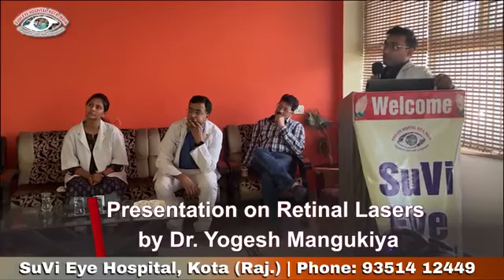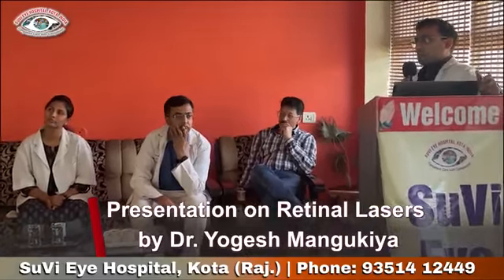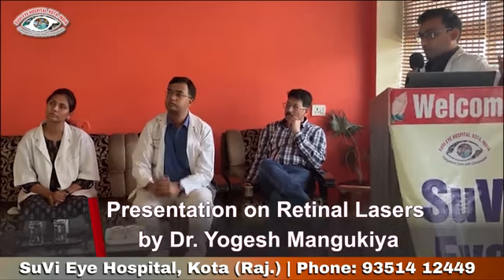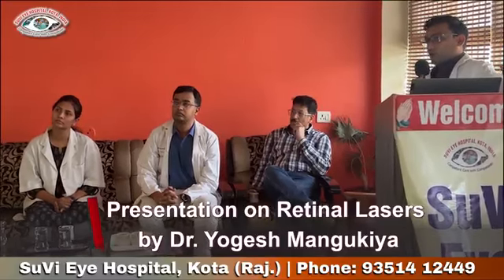Usually for retinal photocoagulation we use around 100 milliseconds duration, and the power will usually be titrated according to the patient's condition.